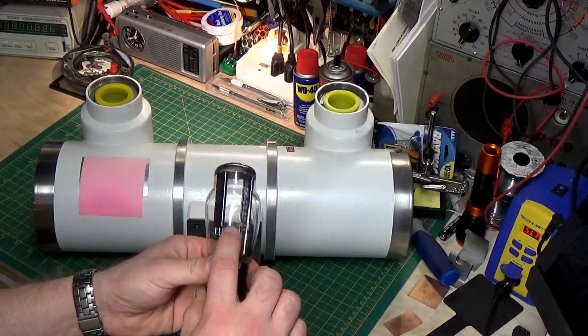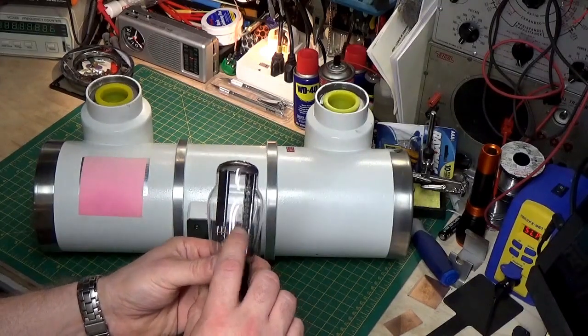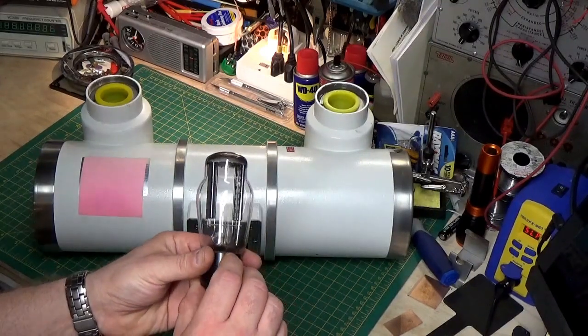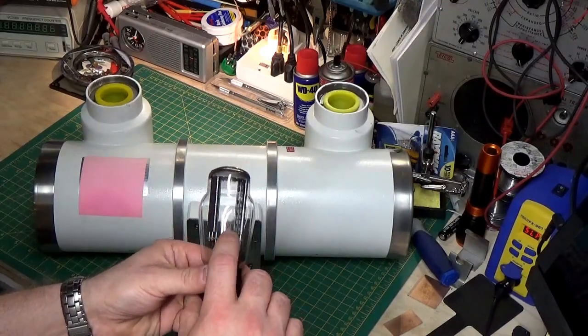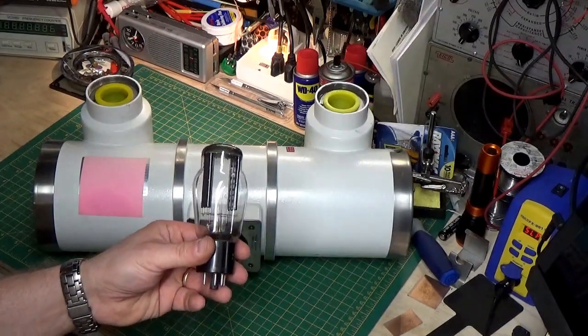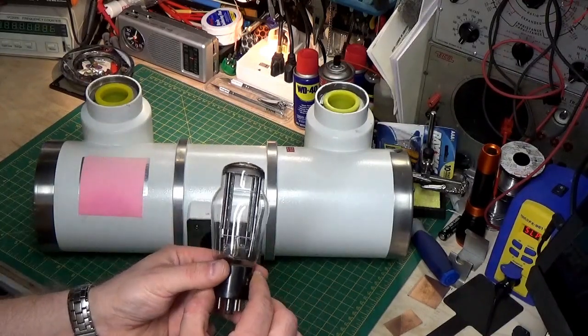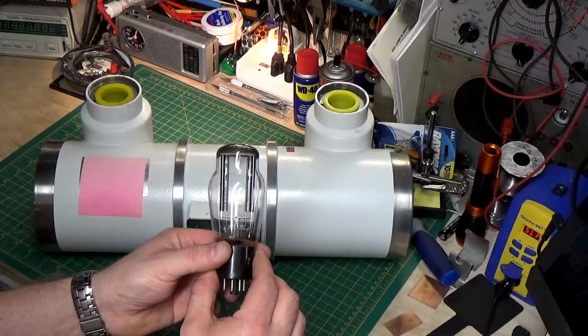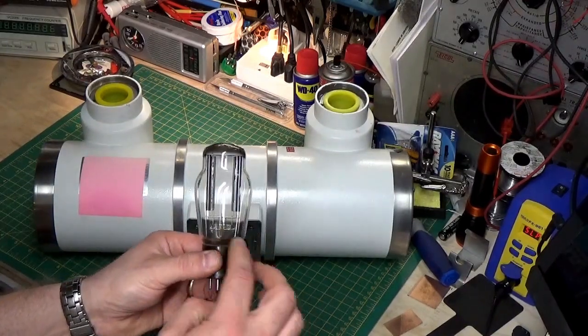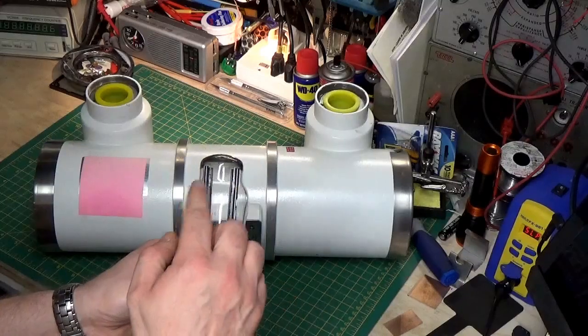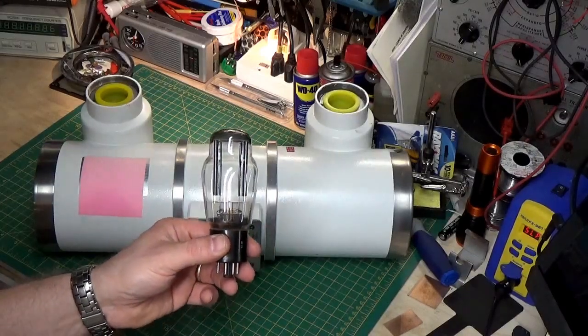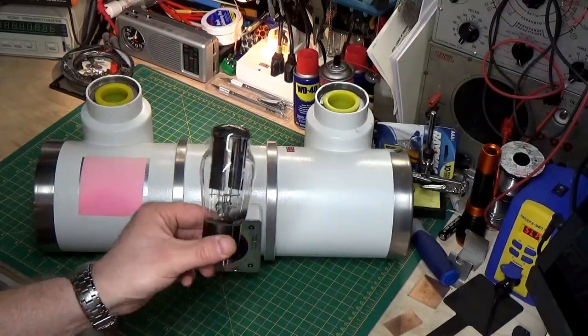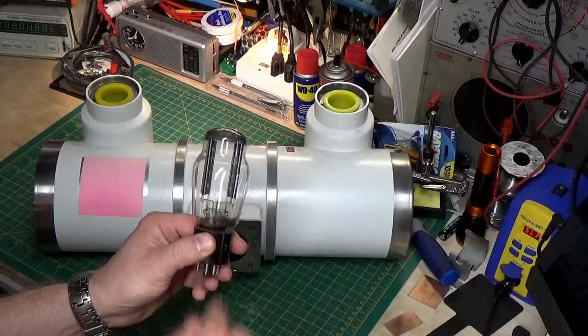It's called a 5U4. The 5 stands for a 5-volt filament. The U is a designator for the factory, and 4 means there are four elements in this: your two filaments and your two plates. So it's a basic diode, anode and cathode, two of them in here.